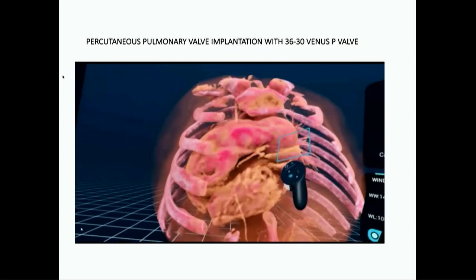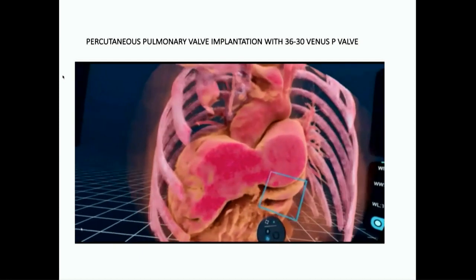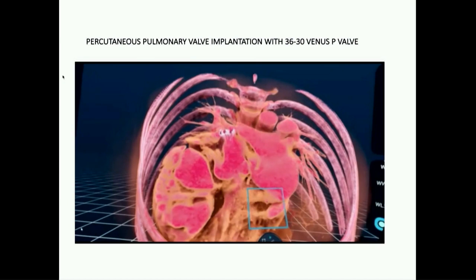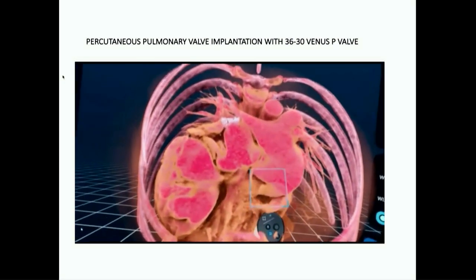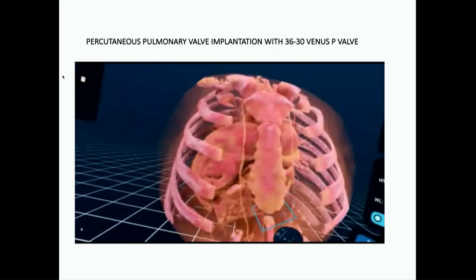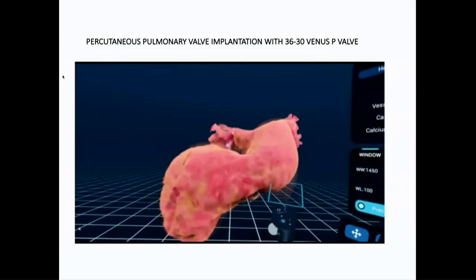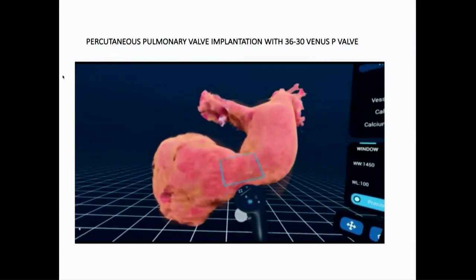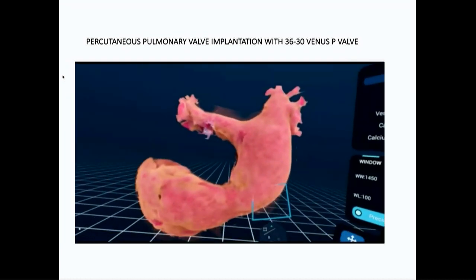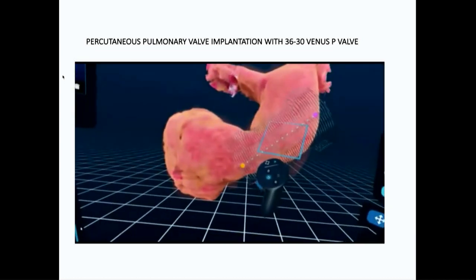This is a 3D volume rendering of the CT of the patient. Here we can see that most of the cardiac mass is on the right side, and the RV is horizontal and more anterior, and the RVOT is dilated. Pulmonary arteries are also dilated. This is a section showing the RVOT and the MPA and the branch PAs. Here we can see that there is an aneurysmally dilated MPA, and the branch PAs are also dilated.